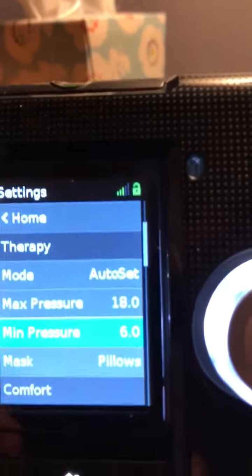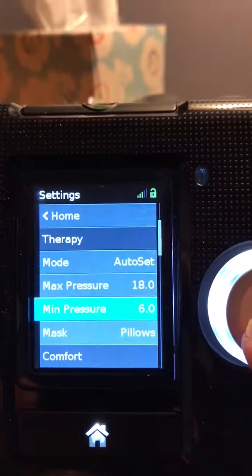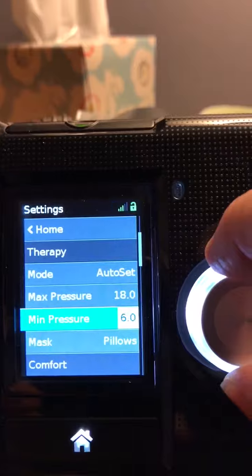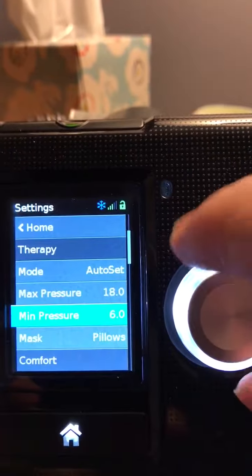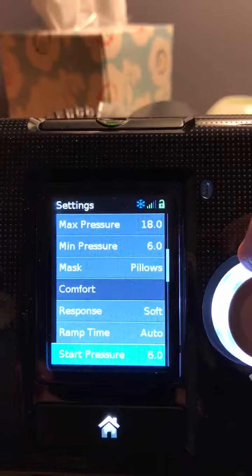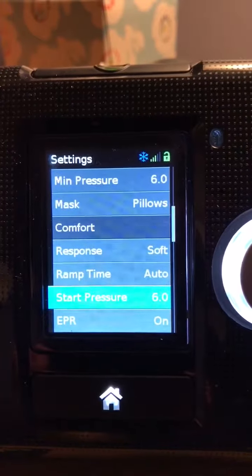I put it at 6 and it seems to be better for me at 6. You could set it wherever. So you hit the button, set it where you want it. Mine was at 5, I set it at 6. Click it. But you've got to go down because this would still be at 5, so you have to go down and set the start pressure at 6.